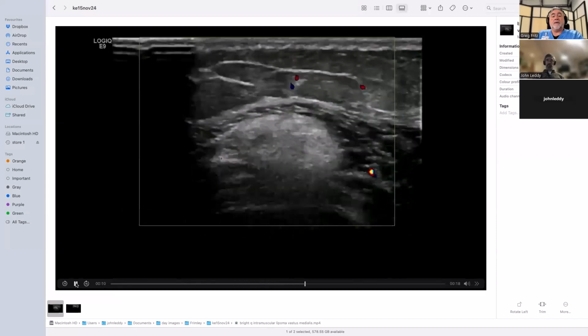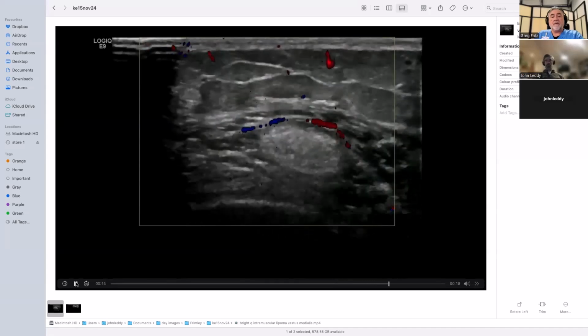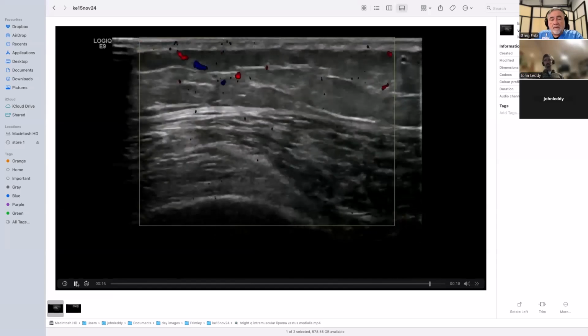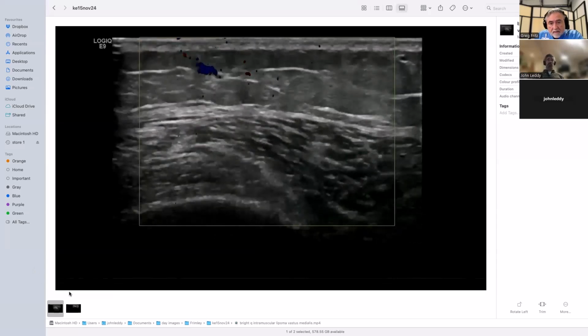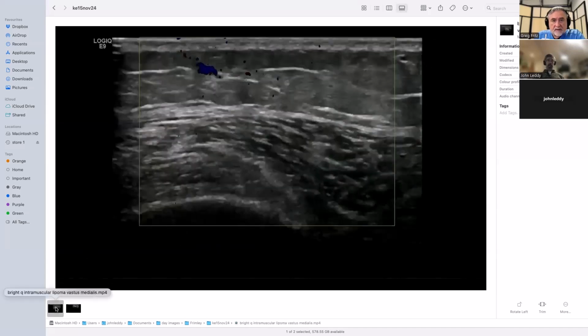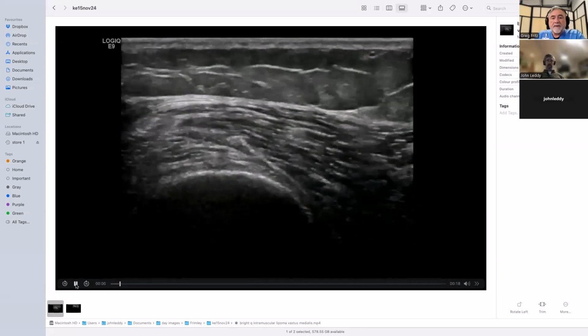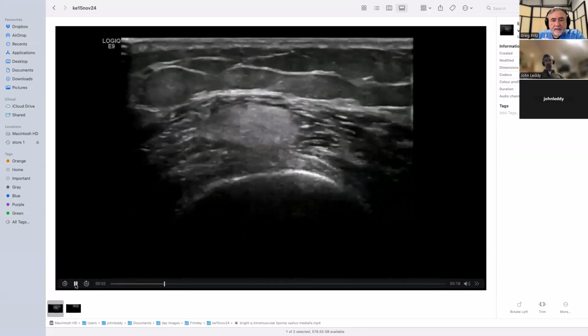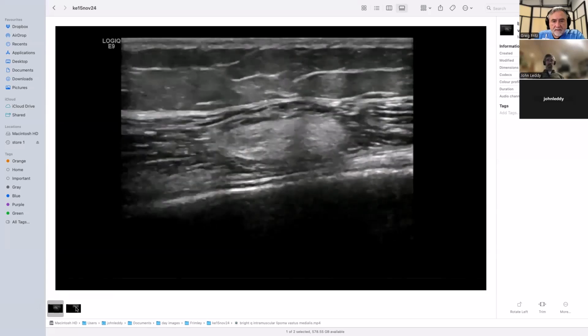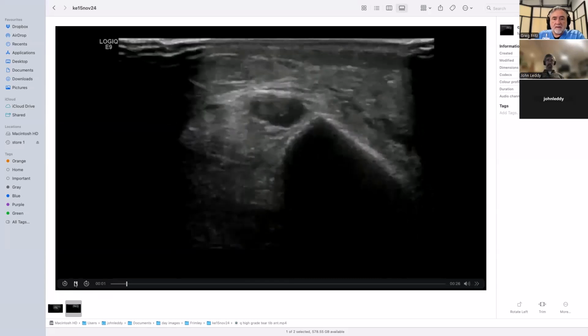Intramuscular lipoma. They're usually less bright than that. It's a less common one. Where is the location of that last one? This one was in vastus medialis. Okay. Just a little unusual, but looks like a fatty lump.